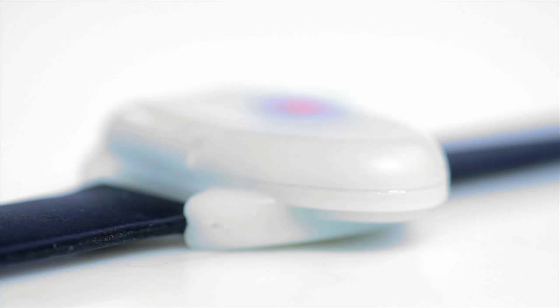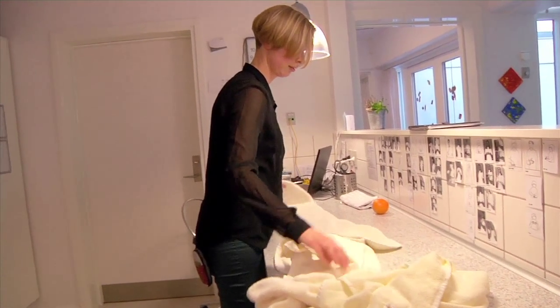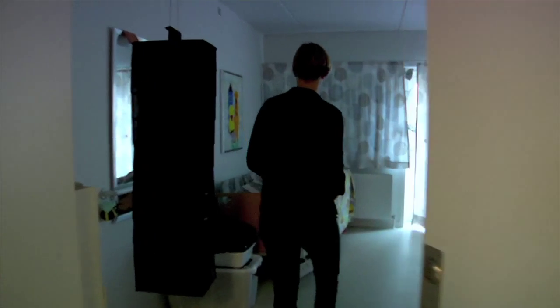When the convulsive movements begin, the armband triggers an alarm and sends signals to the EpiCare control device. From here, a call is made to the designated caregiver — for example, to the caregiver's mobile phone.